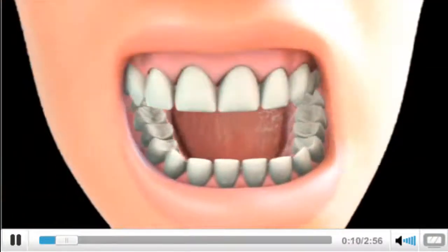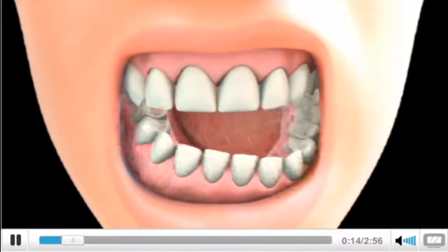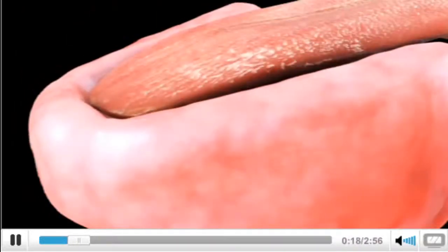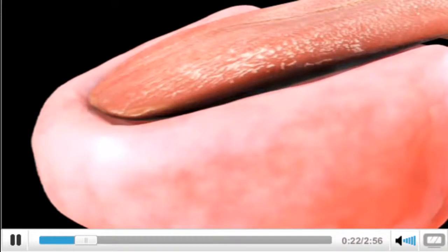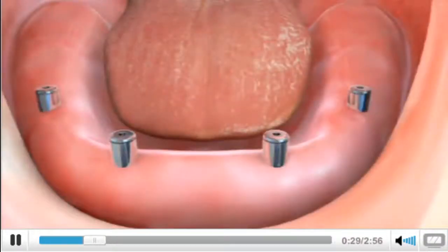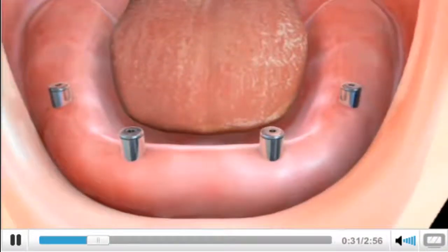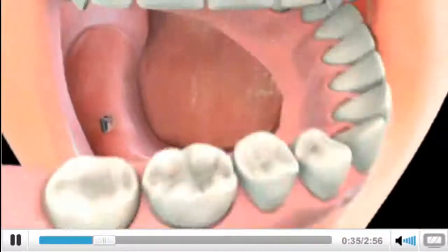While every effort is made to make a good and functional denture, it is sometimes hard to achieve a stable and retentive denture. This is mainly due to the jawbone constantly shrinking with age, smoking, or some systemic diseases such as diabetes, or even chewing pressure on the existing denture. However, there are new advances in making dentures.